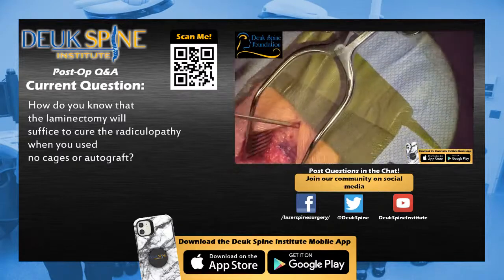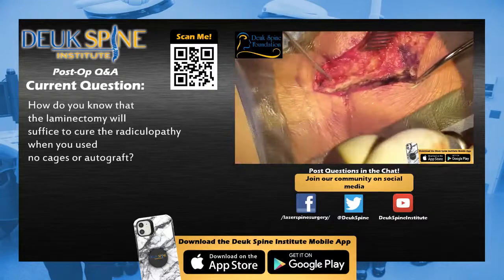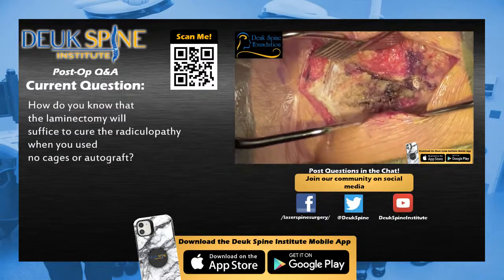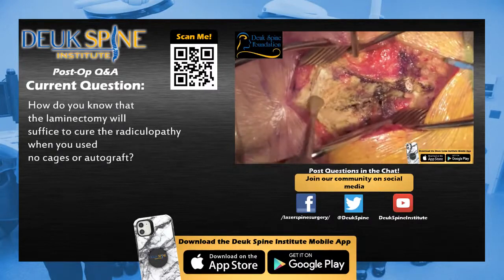And we know the nerves are being pinched there because of the MRI. So MRI is a really useful preoperative tool that we surgeons use in figuring out where the patient's problems are coming from. The MRI never tells you where pain comes from, but it tells you where nerves are getting pinched. It tells you where the spinal cord is getting pinched. You can actually see the pinching on the MRI.